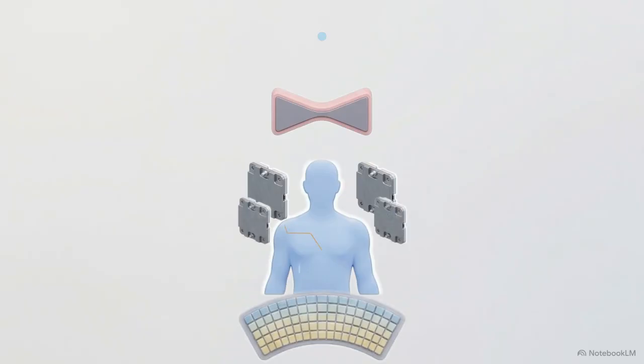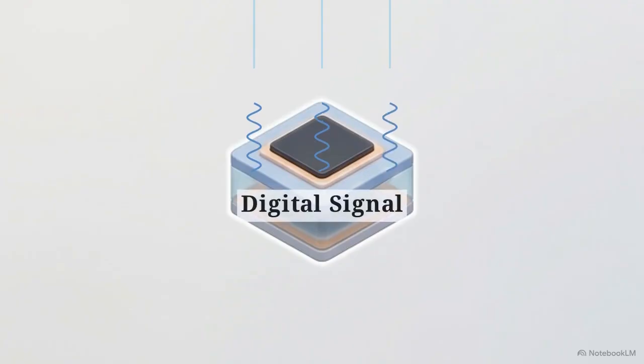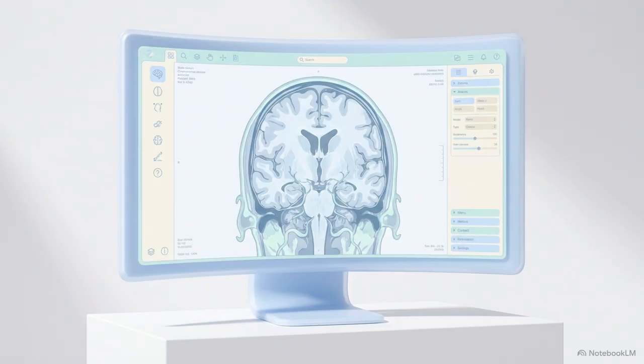The remaining, correctly shaped photons strike the scintillation detectors. Inside, materials like cesium iodide absorb the X-rays and emit flashes of light. Attached photodiodes instantly convert that light into the electrical signals our computers interpret as tissue density. Every physical component hidden inside the gantry works strictly to filter out excess scatter and unwanted radiation, ensuring that only the most precise, useful diagnostic data reaches the digital matrix.